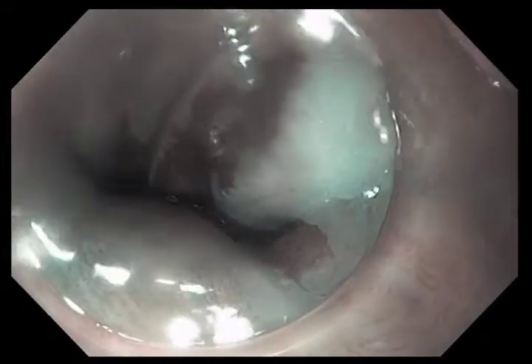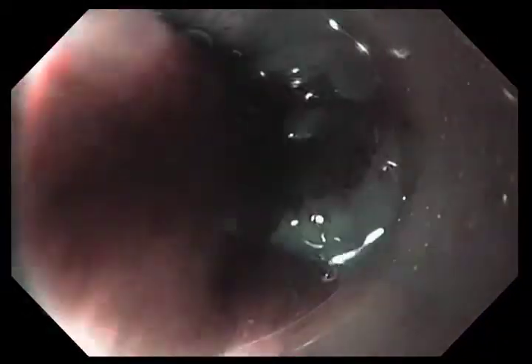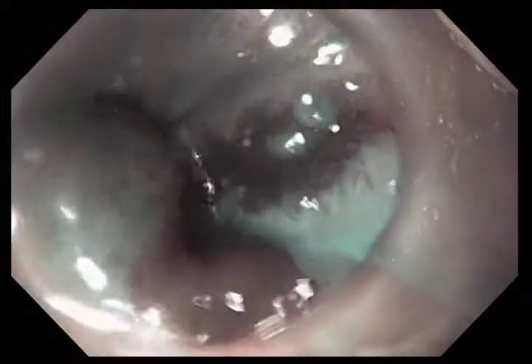You can see here there are several tongues that we're going to treat, as well as that island that's more proximally located within the esophagus.